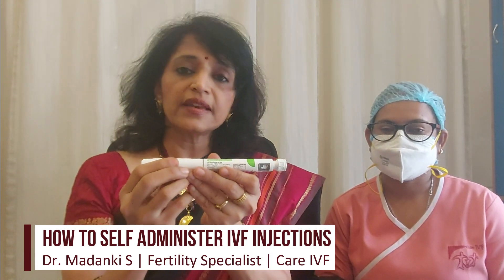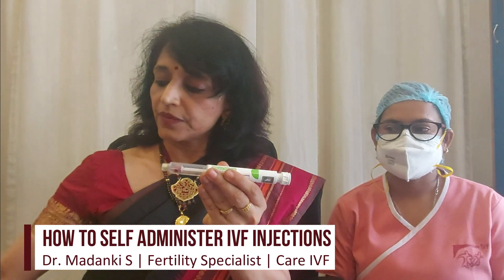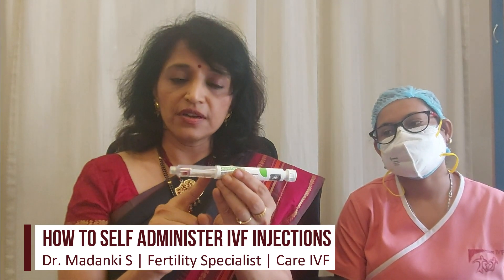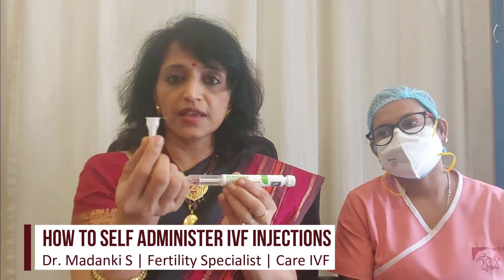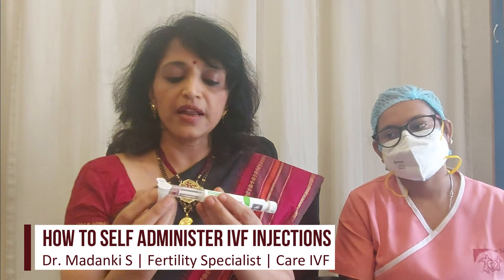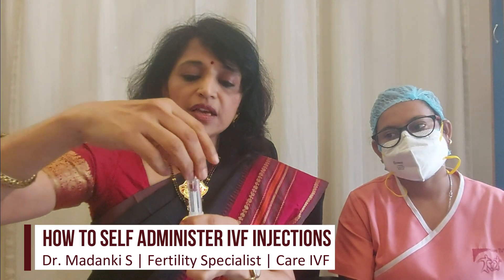Now that you've set the dose, the next step is to open the cap and keep it carefully next to you. You can see the cartridge here, and then we have to fix the needle. The needle needs to be first uncovered and then screwed tightly on top of the pen.